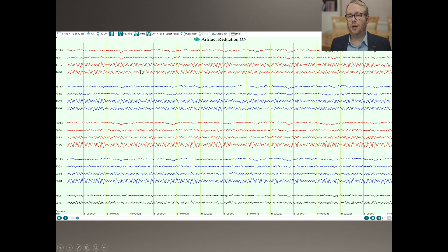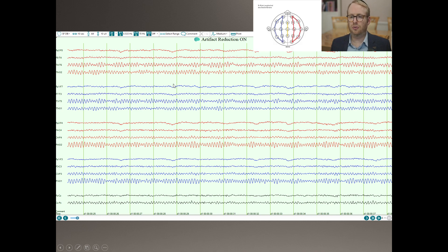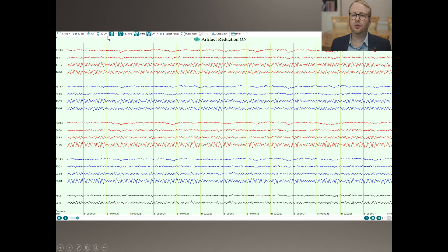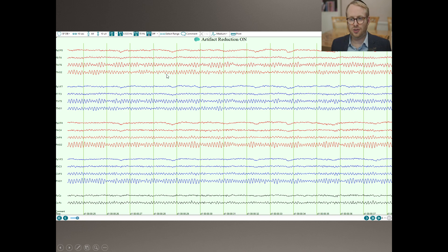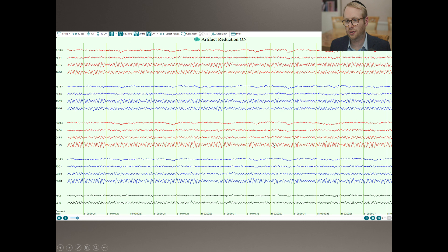This is an alpha rhythm. Right is in red, blue is on the left. We've got the frontotemporal chains for right and left, and centroparietal chains over here, right and left. Each one of these boxes is one second. Counting the number of cycles per second in each box, it comes to about nine — so it's a nine hertz alpha rhythm, nine cycles per second occurring in each box. You can see that as we go from the frontal regions towards the back of the head, it increases in amplitude — it's posterior dominant. You can also see its spindly shape here: it waxes and wanes repeatedly. So that's exactly what an alpha rhythm behaves like in health.